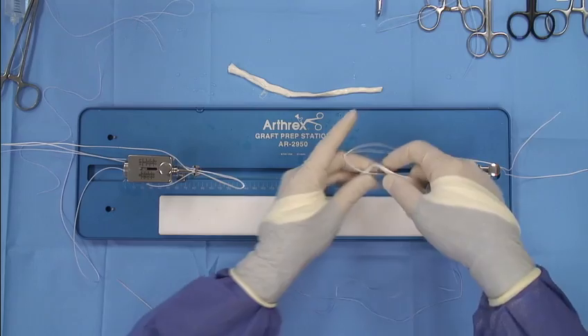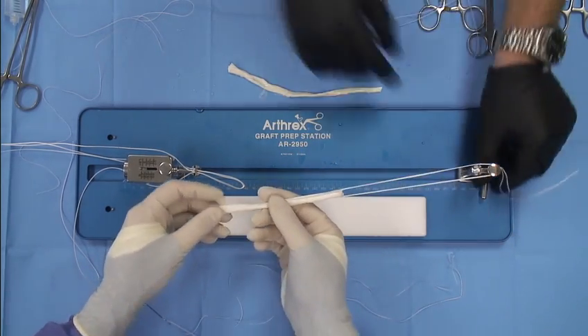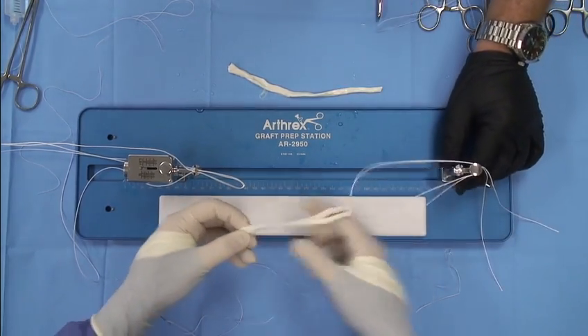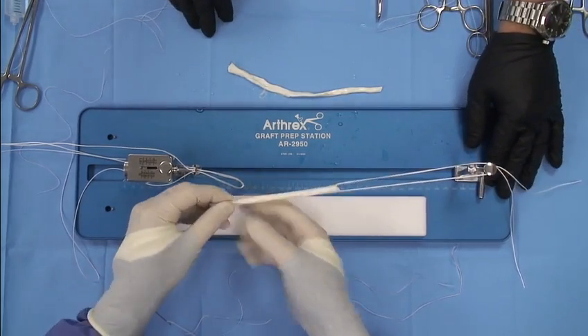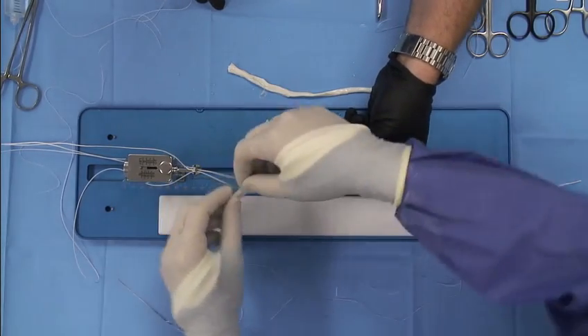Now what we're going to do is go ahead and pass it first on the tibia side. Then when we come back the tibia might be a little smaller, which is anatomic. We'll keep this tightened down all the way right there. And in order, once you get these even, your assistant will pinch it right here so they stay even.